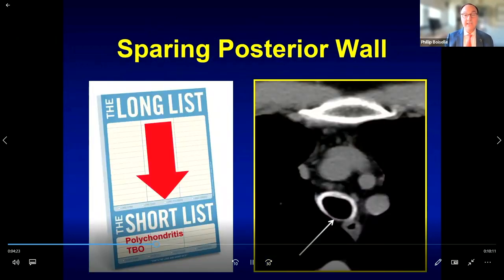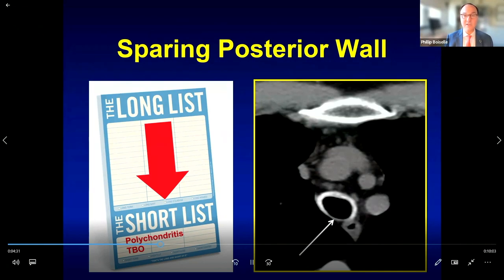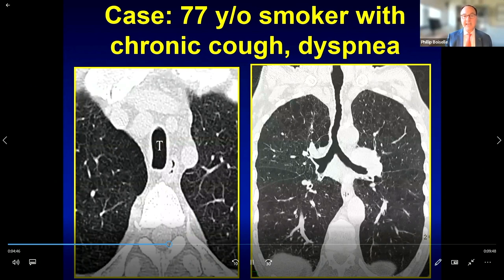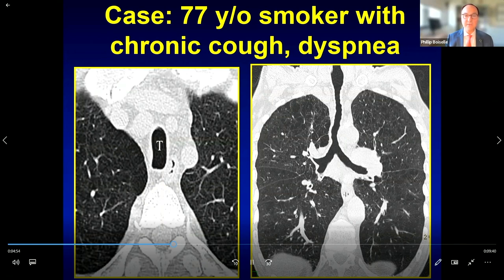When tracheal wall thickening spares the posterior membranous wall rather than showing the Cheerio appearance, think about diseases that target the cartilage. In this case, anterolateral wall thickening with calcification is due to relapsing polychondritis. Here is a case of diffuse tracheal narrowing — on the axial image we see a narrow coronal diameter and elongated sagittal diameter, and the patient also has emphysema on lung windows.